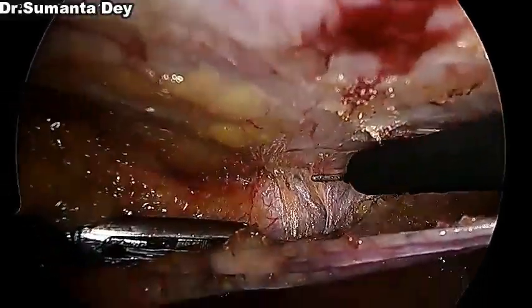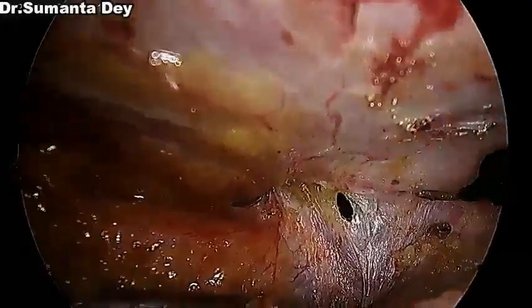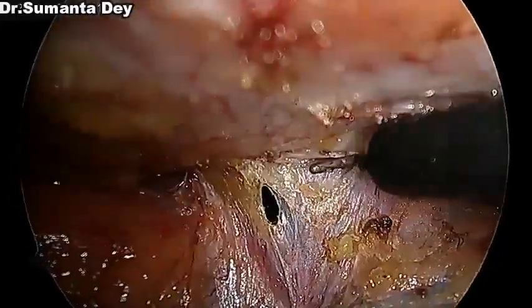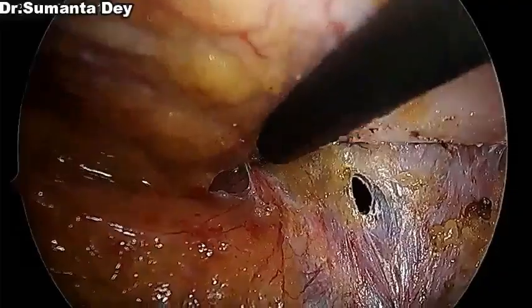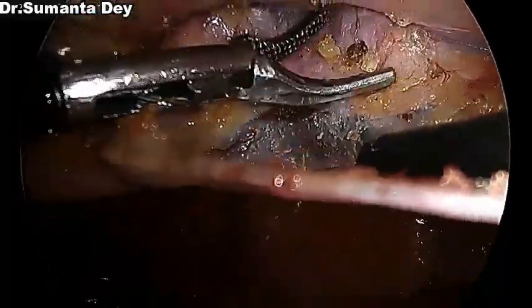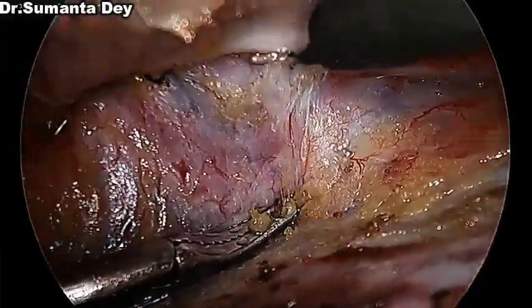Now after dissecting around the hernial defect, I am now trying to target the hernial sac. Before embarking on hernial sac dissection, you should always dissect all around the hernial defect as much as possible, so that you can have enough space to venture into this area. And you can see I am giving a good amount of steady traction with the left hand instrument.